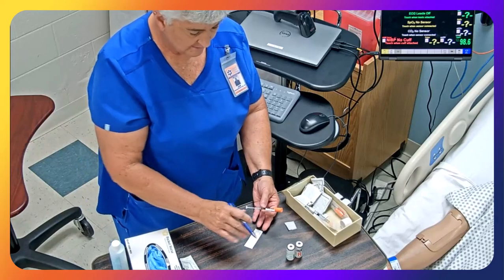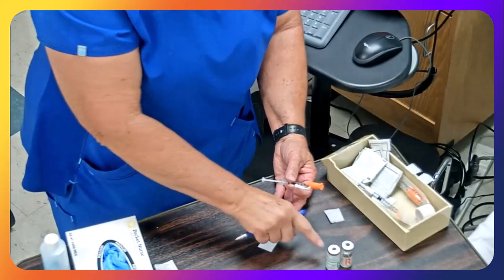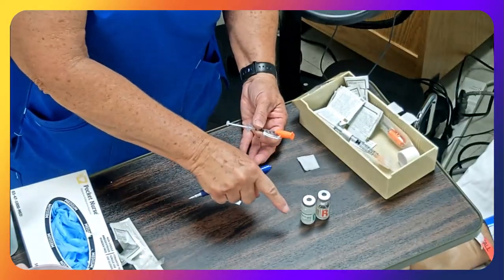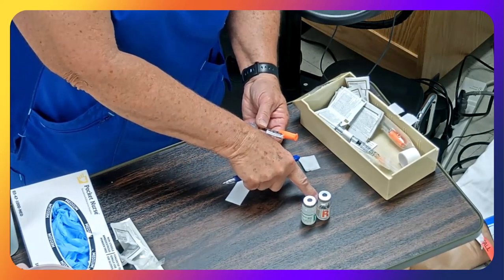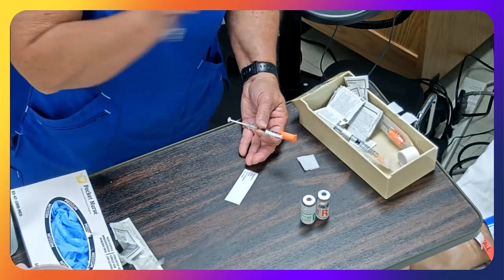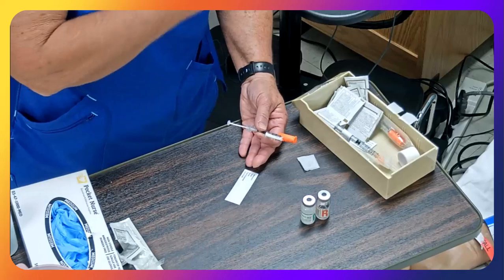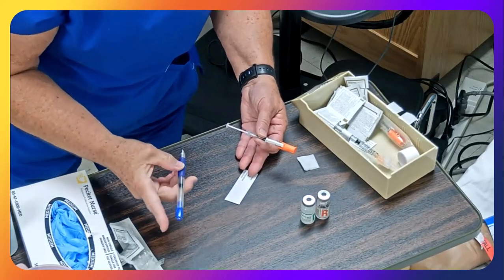So with insulin, you do clear to cloudy, because with NPH, we do not want it in the regular. So we put the air in the cloudy first, then we put the air in our regular, drew it up, had to verify it, and then went to our NPH insulin, drew up our 12, which was the total of 20, and had 2 personnel verify it again.